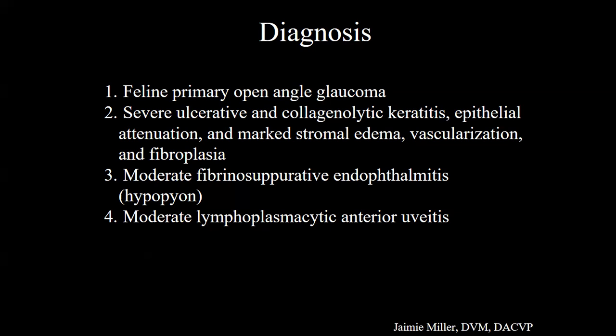Yeah, those epithelial cells in the stroma were interesting. Kind of an unusual finding. I think if there was collagen-lytic keratitis, it was gone by now, right? Because there's basically the opposite now. It's a granulation tissue. So I don't know how to consider that presence of those cells deep in the stroma and what we're seeing now. I think it could be that there was a collagen-lytic process at some point and the cells just got stuck there.